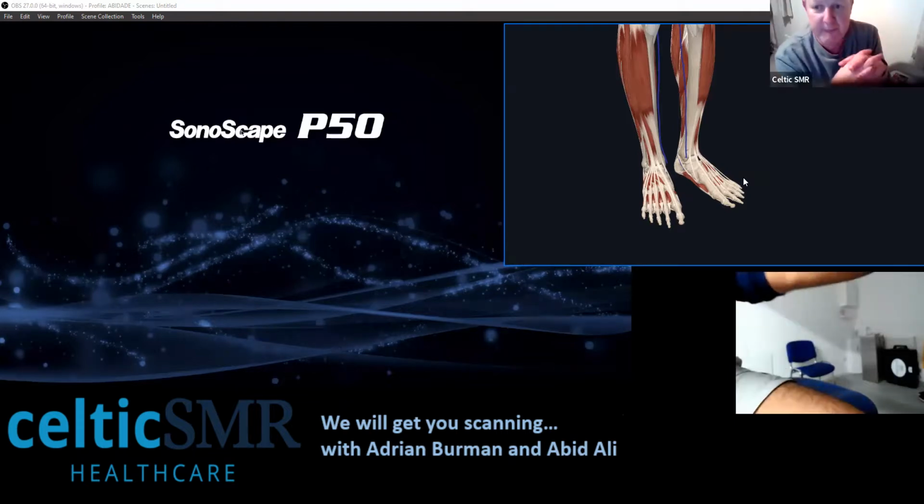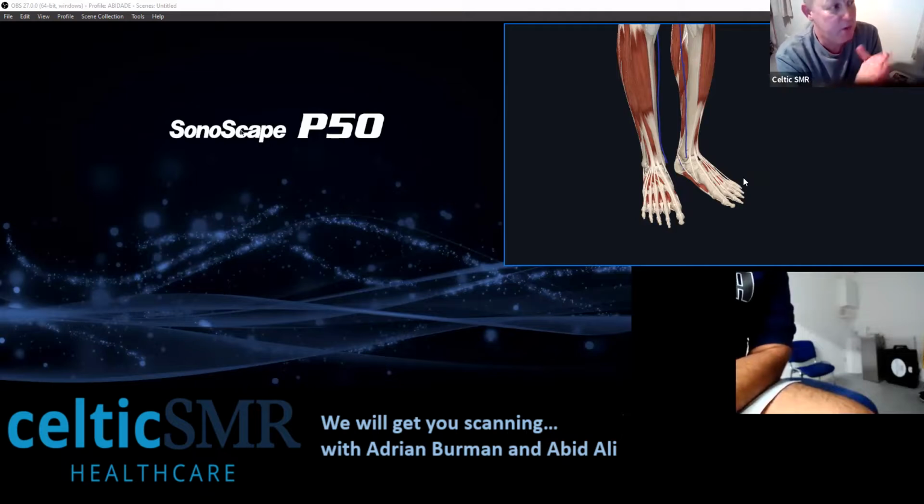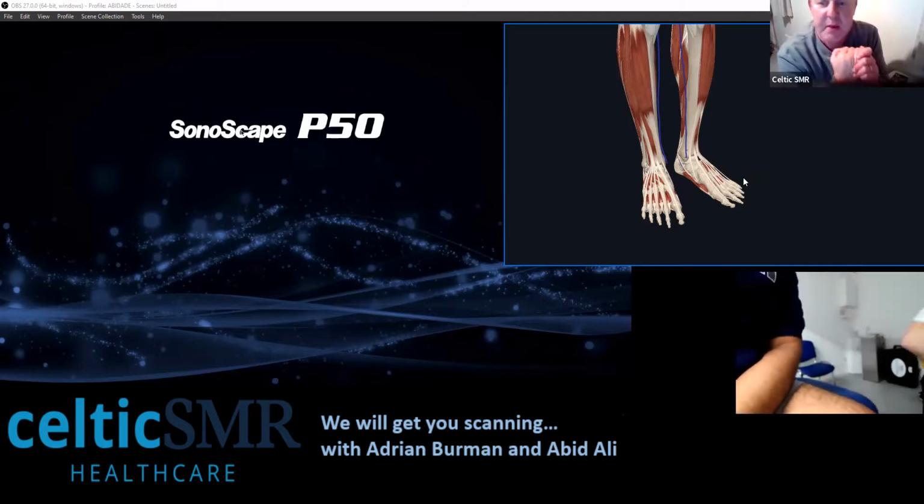Yeah, we can't wait. All practical, a little bit of talky, then we're just getting stuck in. And really looking forward to getting back in the classroom, so to speak. Getting some hands-on practical, rather than you watching us on a video. Yeah, brilliant. And the plan is that there'll be no more than 3 people per scanner, and you'll be scanning all day long. We're going to focus on the ankle and knee in this first one, but we'll be doing more throughout the summer and so forth. So yeah, really excited about that. So excited I almost forgot.